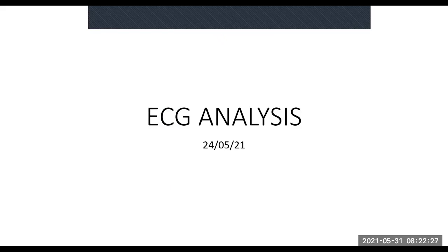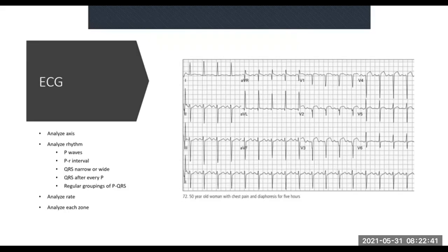Come sit. All right. So we're going to start with our ECG analysis for today, just to go through and see what we can learn. I hope today's is a nice one. I can't remember what it was. Oh, yeah, it's a fun one. Okay, that's good.